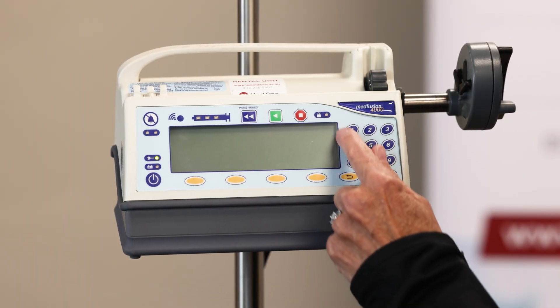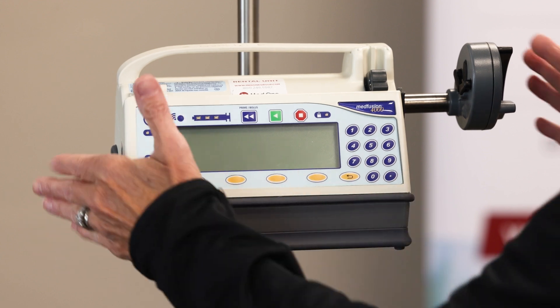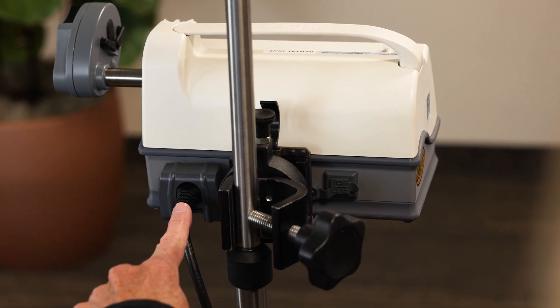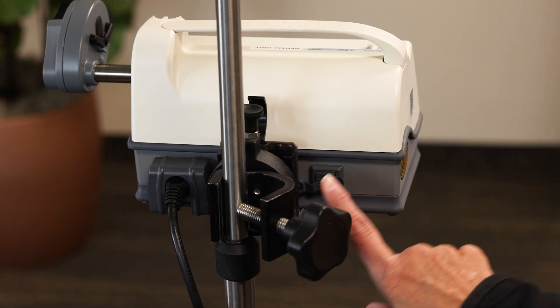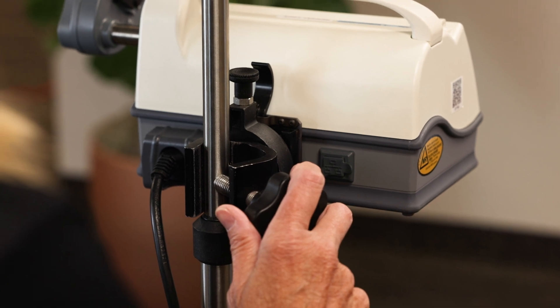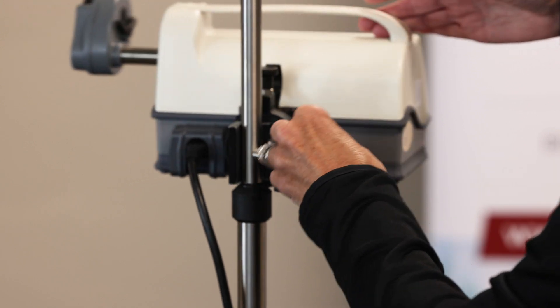Right here is your keypad and your decimal. Now if we flip the device around and show you the back, this is where your power cord attaches. This is your ethernet port, for any transfer of drug libraries or data. And then this is what's called the optional pole clamp mount — that's an option you can have — and then just the base of the syringe pump.